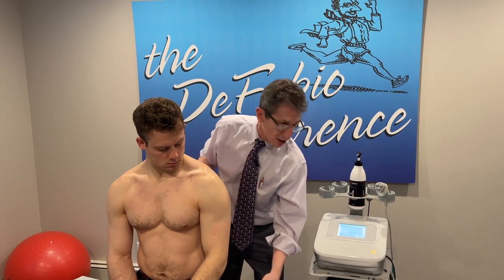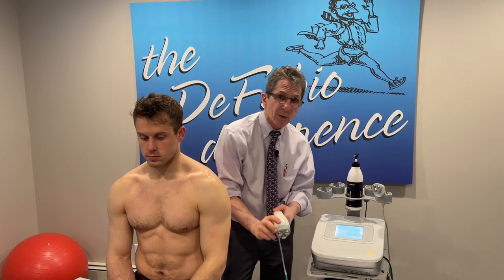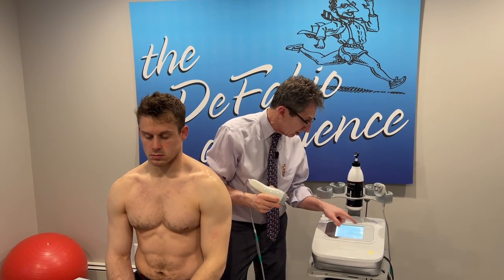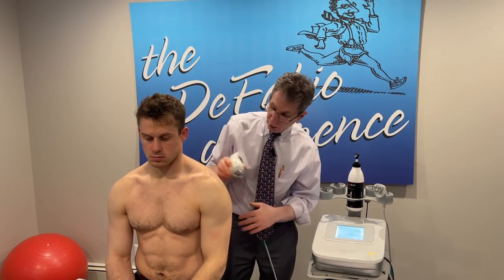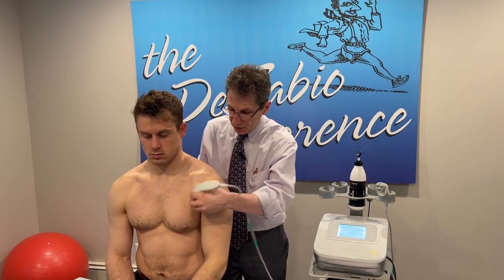If we want to do both at the same time, we just hit the pause button, go to the mix button, and tell it we want to use our multi-stick. This gives us both superficial and deep therapy at the same time.